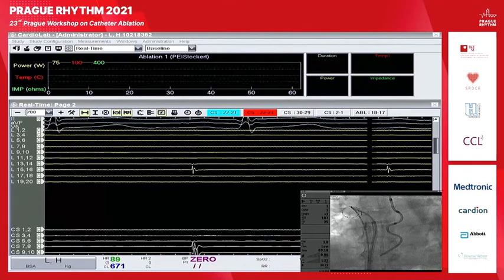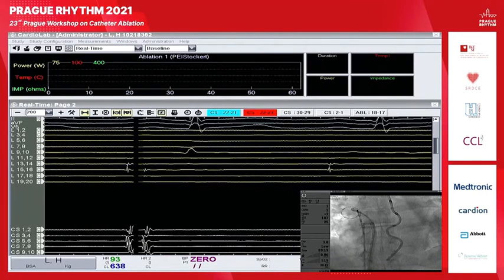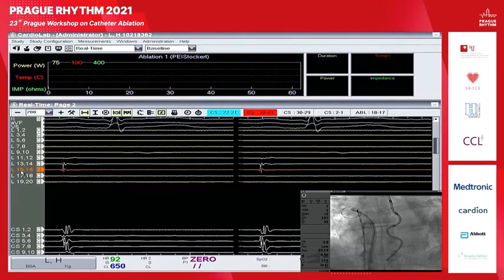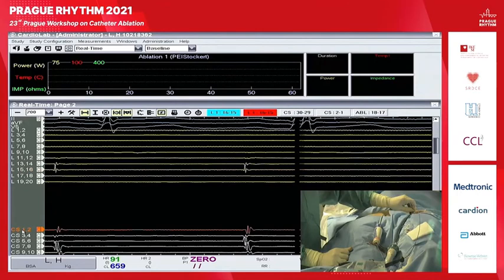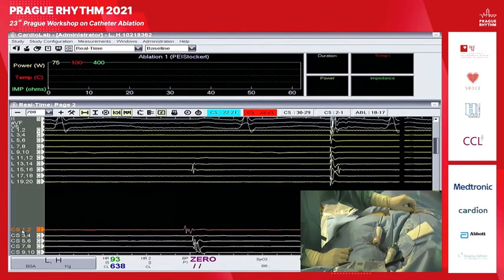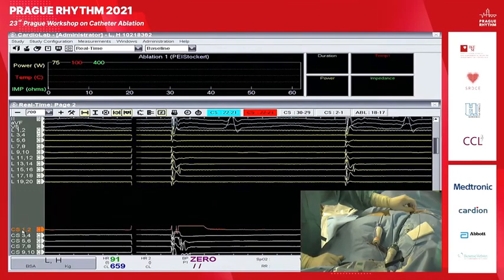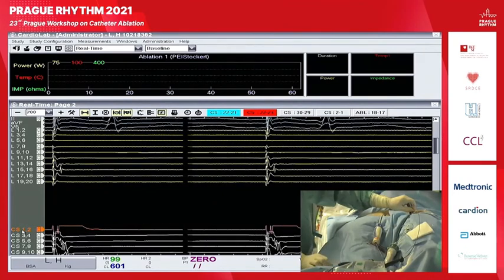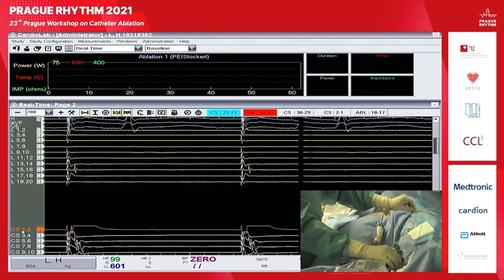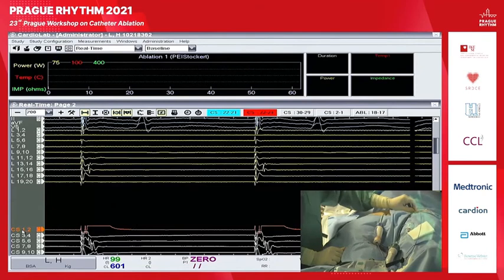It signals at the beginning of the P waves. Can we pace CS1-2? It's very early. It's potential. CS1-2 pacing. I mean, this should be real. Can you pace faster? Okay. How much output do you have? Okay, I think it's real. So this should be far field. Yeah. That's good. Okay. So, guys, what do you have?